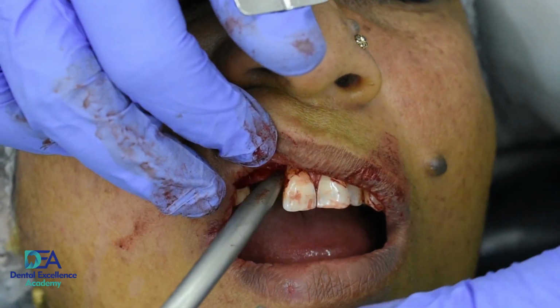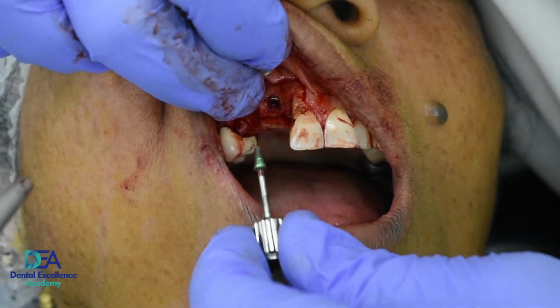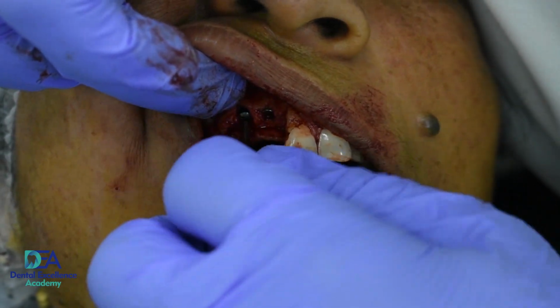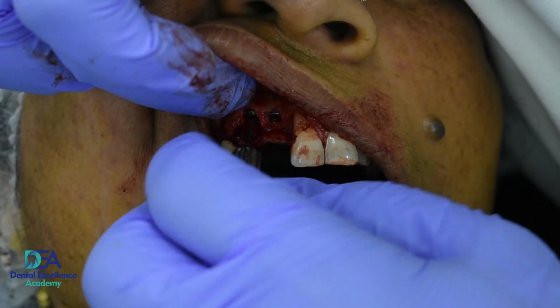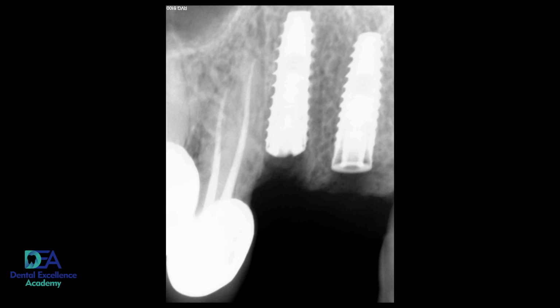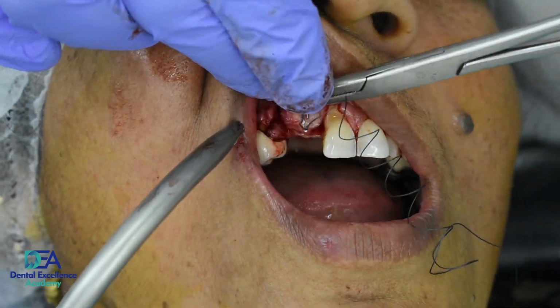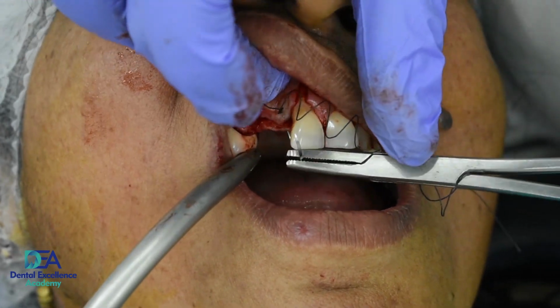Now I'm placing a cover screw. So see, it is almost parallel to each other, and radiographically you can see it is subcrestal, but it is equicrestal on the buccal aspect.